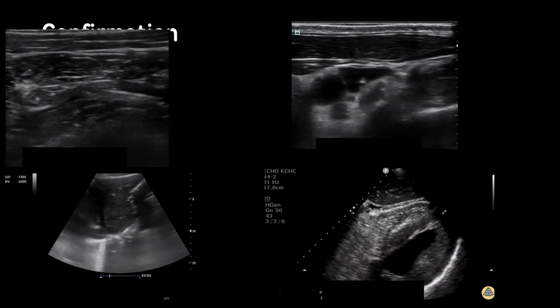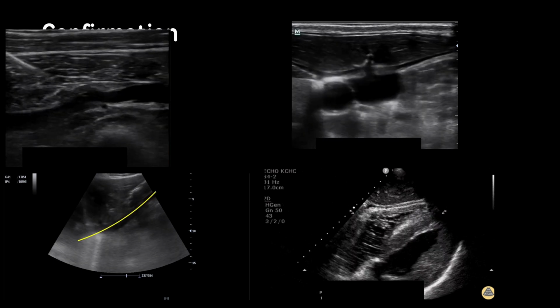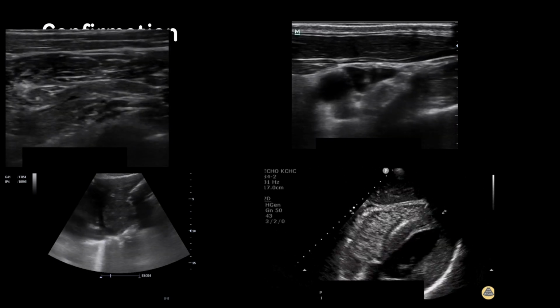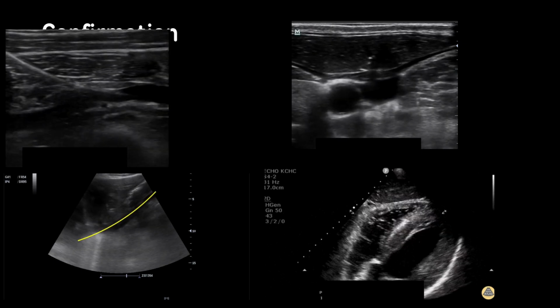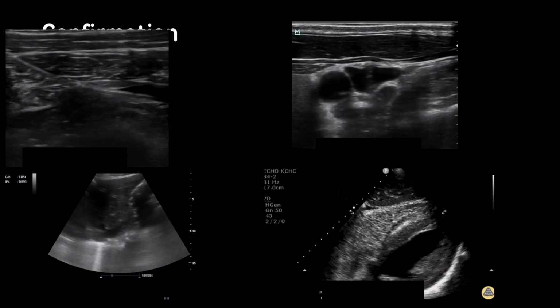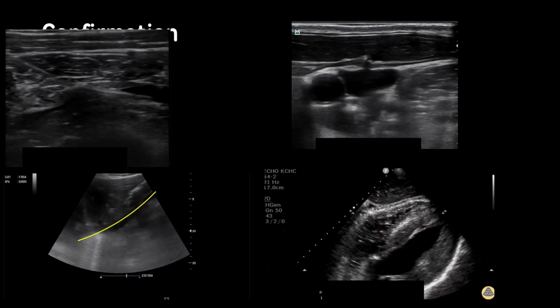So it really helps because we don't really have a C arm. Well, we have a C arm, we're not going to use that. If you use a femoral lead, then you can follow it up to the IVC. But once it hits the right atrium, you still need to get it into the RV. So you've still got to come around the corner. I think it's probably easier to put it in the internal jugular, where you've got more chance to get it in the RV.